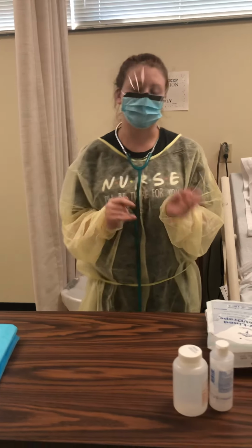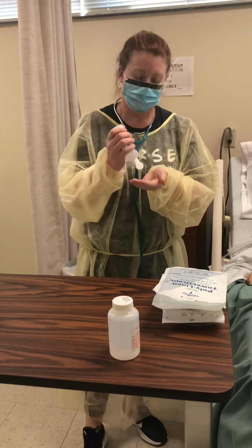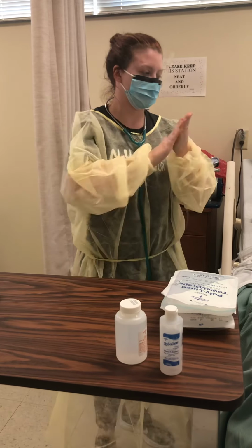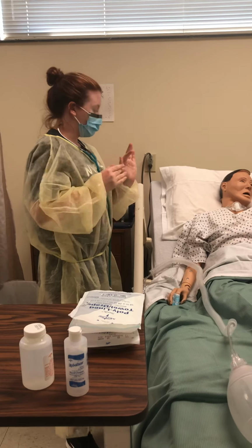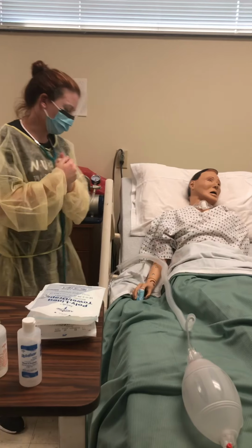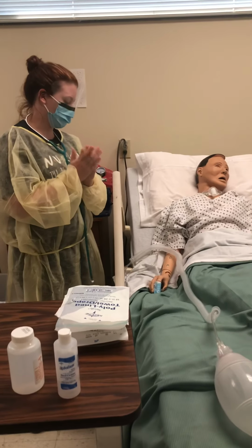Okay, first of all, I'm going to perform hand hygiene. I'm going to introduce myself to the patient. Hey, my name is Savannah, and I'm going to be your nurse today. I'm going to identify the patient using 2 identifiers.